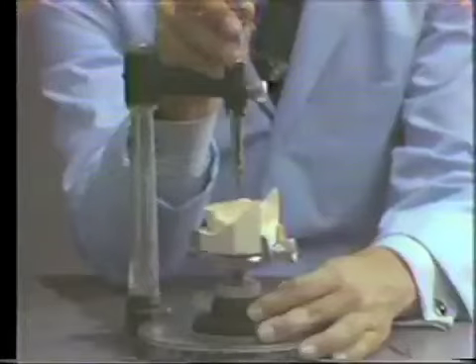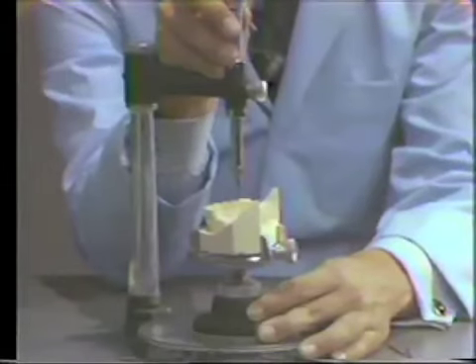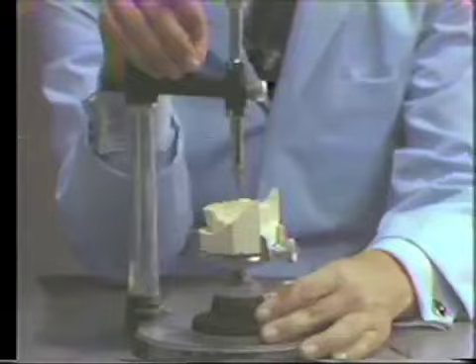We see there's a very, very slight undercut at the cervical third of the tooth. Not enough undercut for the retention of the cast clasp or a proposed cast clasp on the remote abutment of this class 2 situation. If we move the cast to the mesial slightly, putting the retention even further forward, we may pick up a little bit more retention, but we are not picking up much at all.